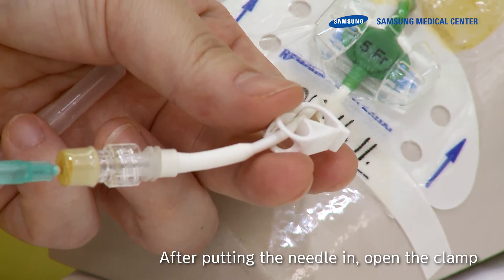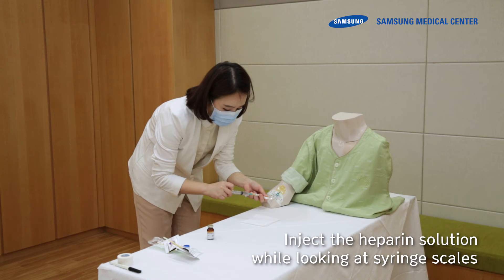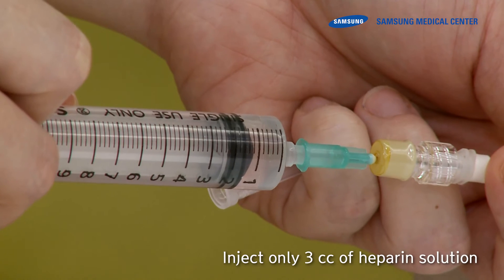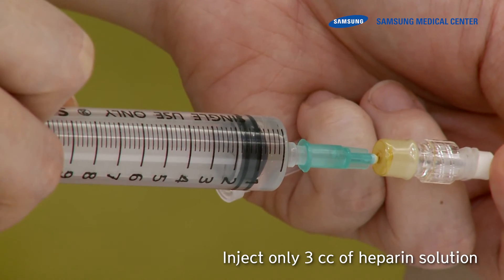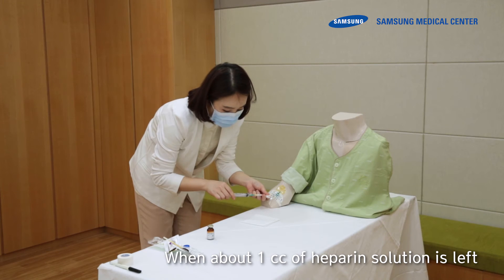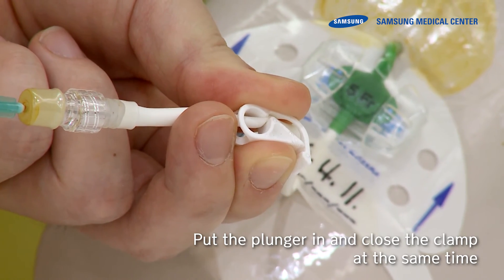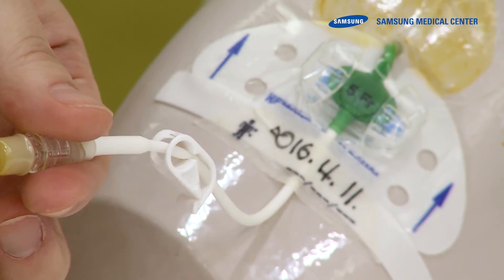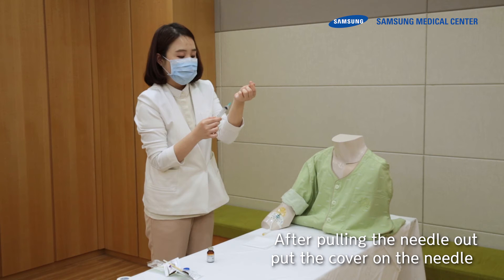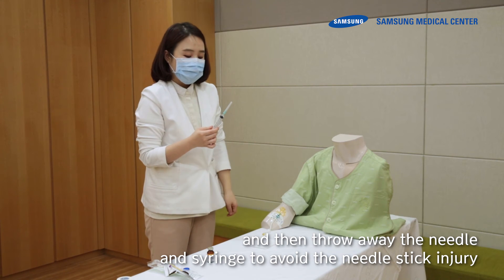After putting the needle in, open the clamp. Inject the heparin solution while watching the syringe scales. Inject only 3 cc of heparin solution. When about 1 cc of heparin solution remains, push the plunger in and close the clamp at the same time. After pulling the needle out, put the cover on the needle and then dispose of the needle and syringe to avoid needle stick injury.